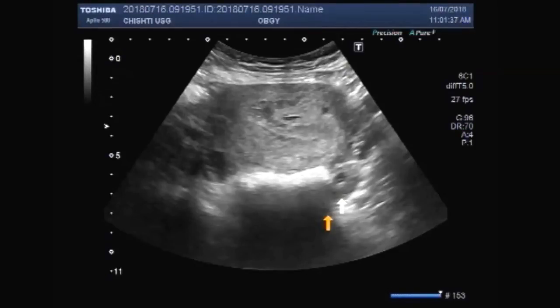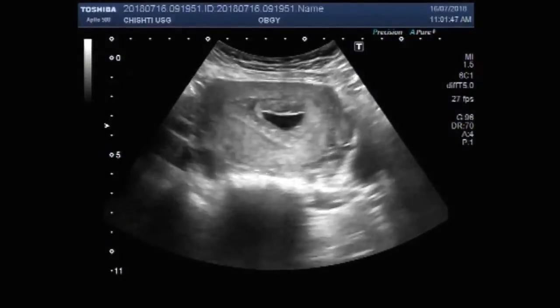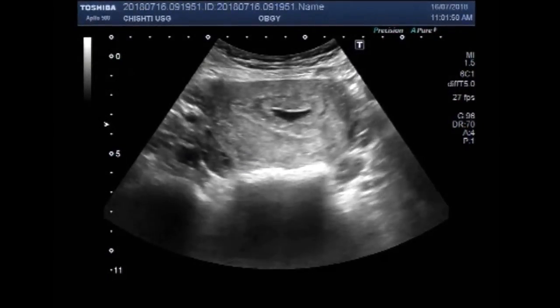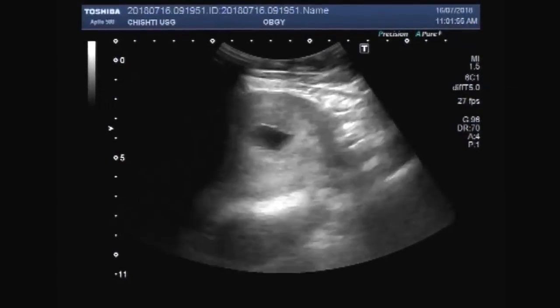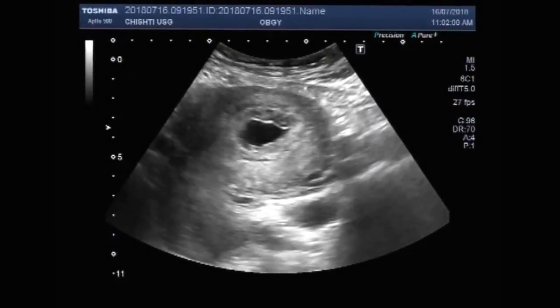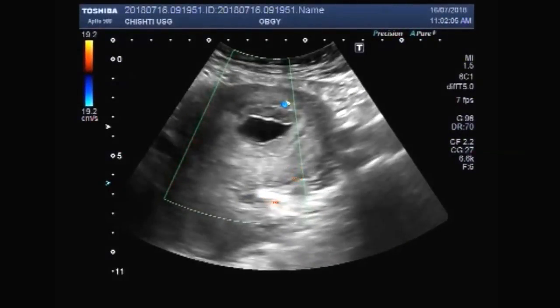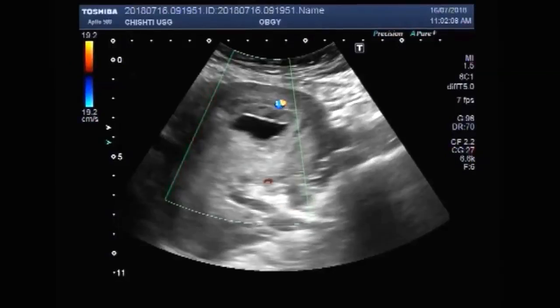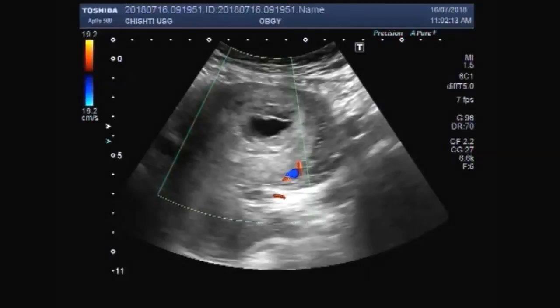You can see the right ovary. This is the left ovary. You can see the uterus having a gestational sac, but no fetal pole is visible inside the gestational sac. No blood flow is seen inside the gestational sac. No products of conception are seen inside the gestational sac.